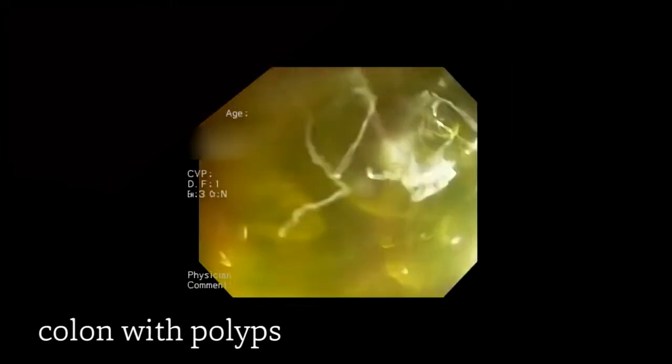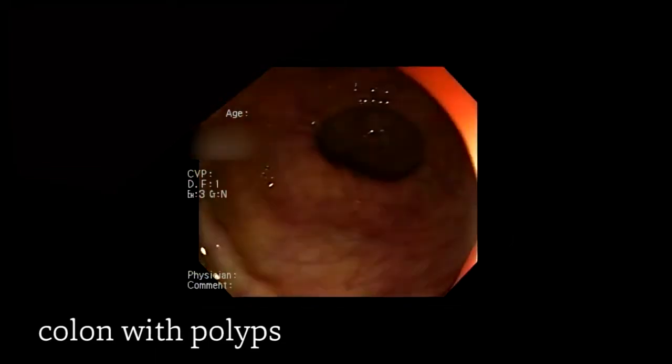We are slowly removing the colonoscope until we reach again the starting point of the rectum, in which we'll do the retroflexion and conclude our exam.